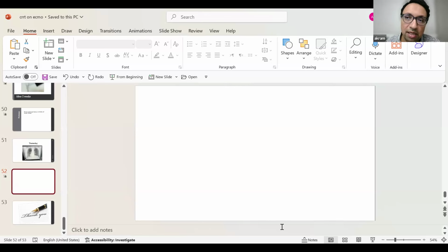The blood is recirculating in the same way. Only if you are draining from the deoxygenated limb and returning back into the oxygenated limb after the oxygenator, which we usually avoid to prevent incorporation of air into the circuit, you don't have a problem with monitoring of oxygen therapy. So you use the CRRT in the deoxygenated limb, not on the oxygenated limb at all. This is what I get.